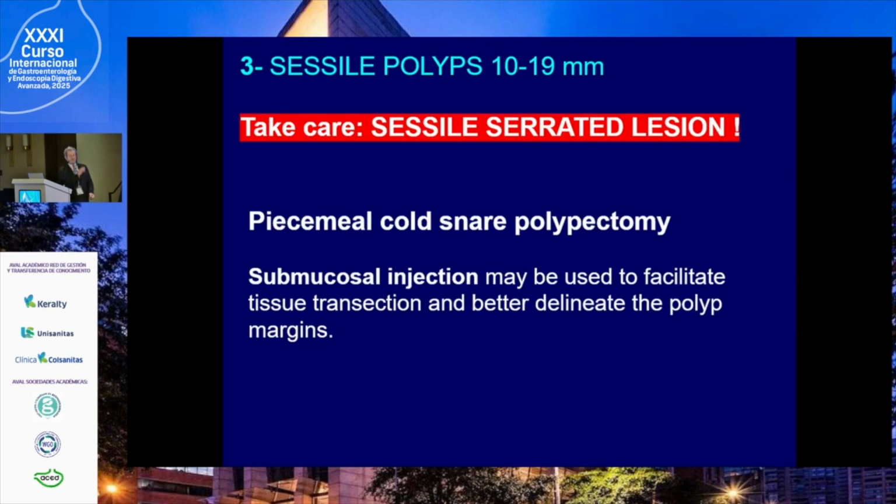Now, we change. This is no more adenoma. This is a sessile serrated lesion, okay? Sessile serrated lesion.